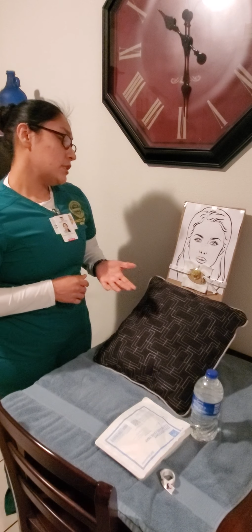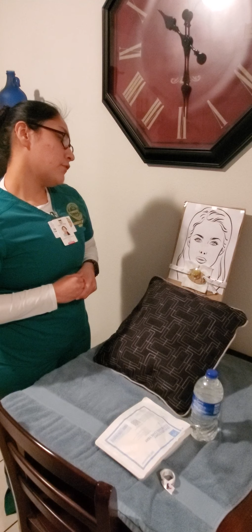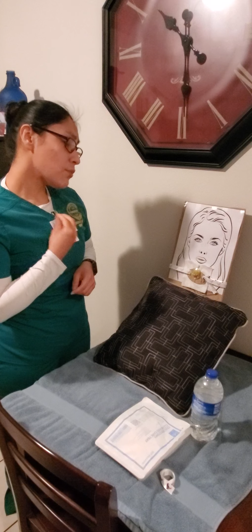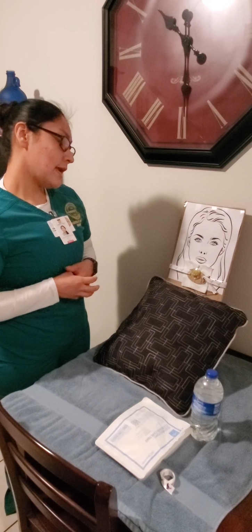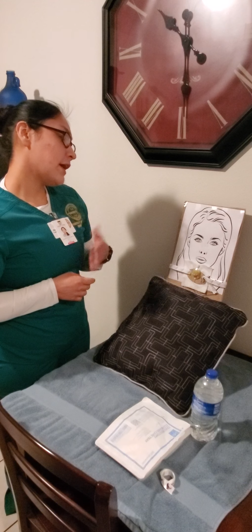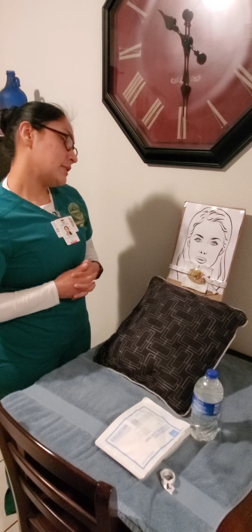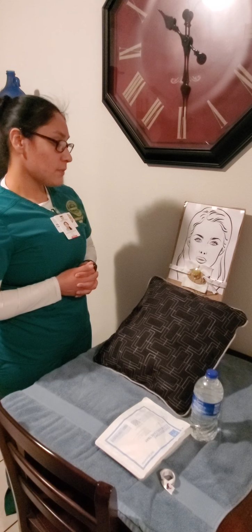So I go ahead and proceed to explain to my patient what I will be doing. I'm here today to perform tracheostomy care. What that is, is that I will be removing your inner cannula so I can go ahead and cleanse it and rinse it, as well as clean around your stoma and your faceplate. This is to remove any residue and to maintain your skin's integrity. But before I begin, are there any questions or concerns about the procedure?